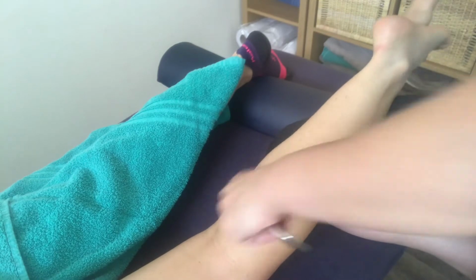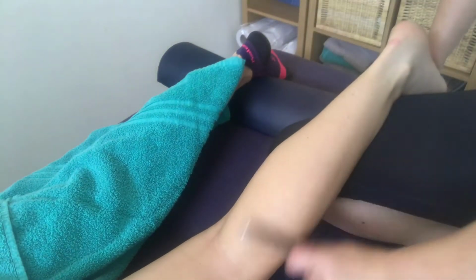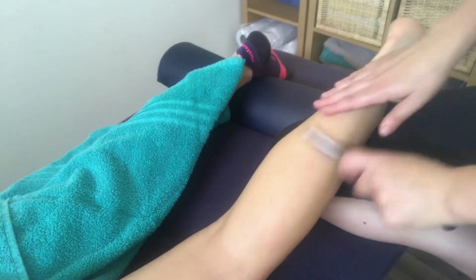And then here is some passive STR work, so taking the foot into dorsiflexion and using the tool at the same time.